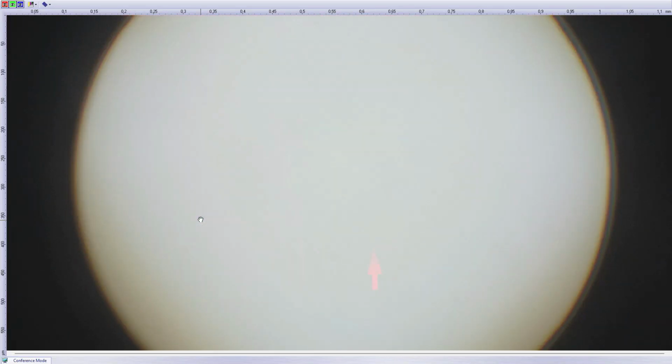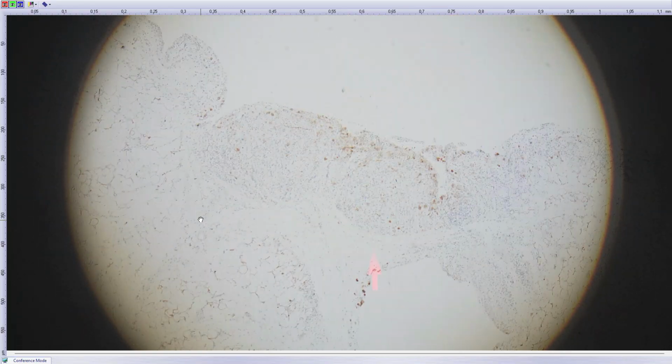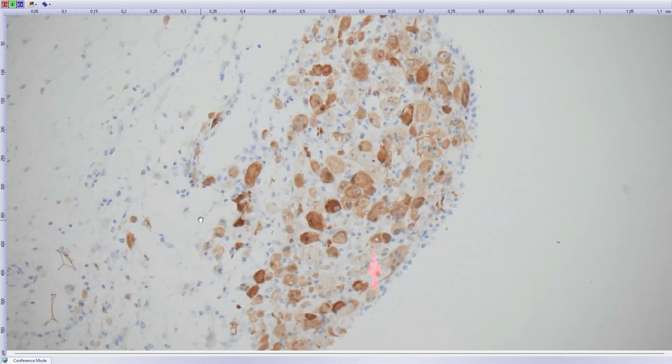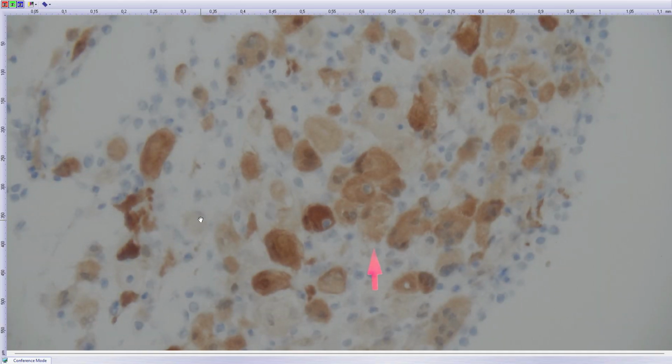So what would be the stain or the stains to do? S100, CD68, perfect. So it's S100. It's beautiful. It's everywhere we need it. And this S100 stain is great to confirm, or not absolutely confirm, it's not 100% specific, but it's useful to confirm the suggestion of Rosai-Dorfman.